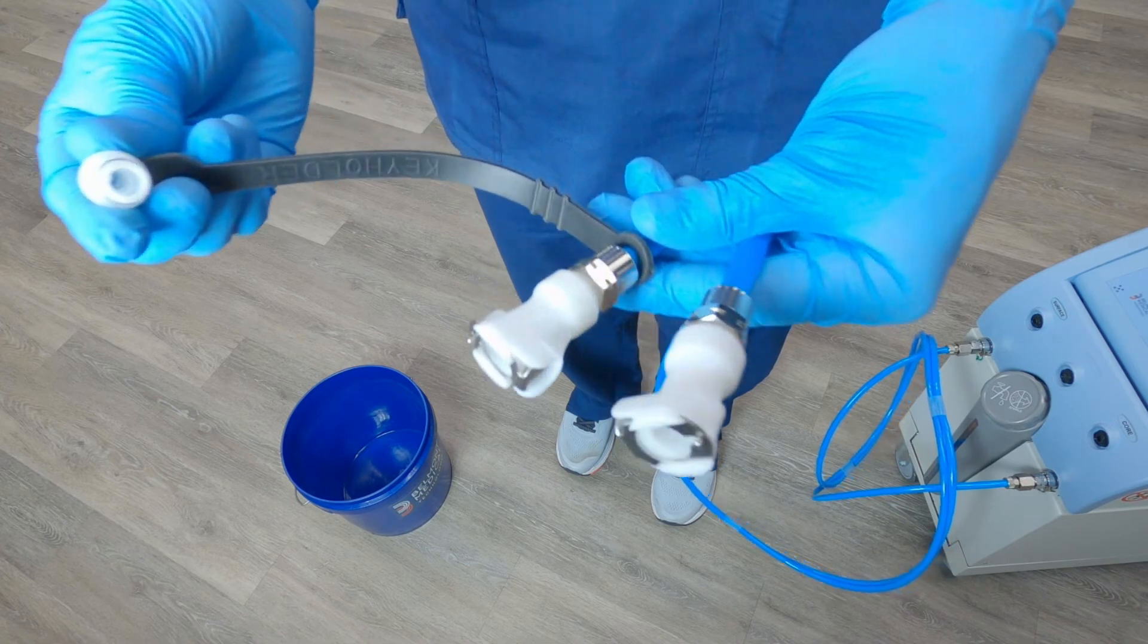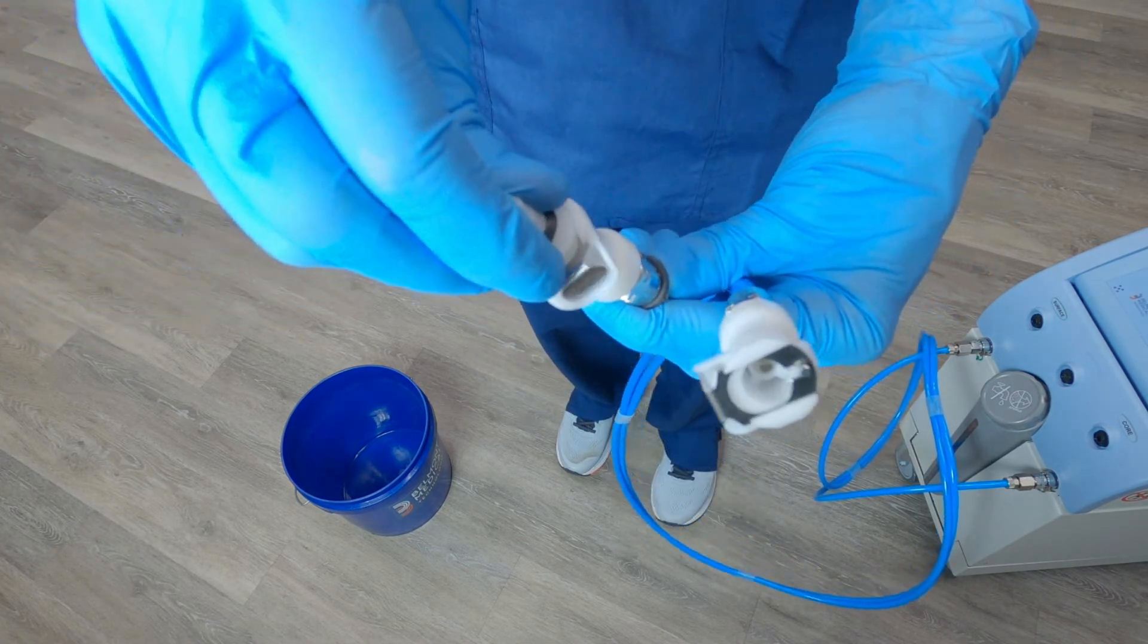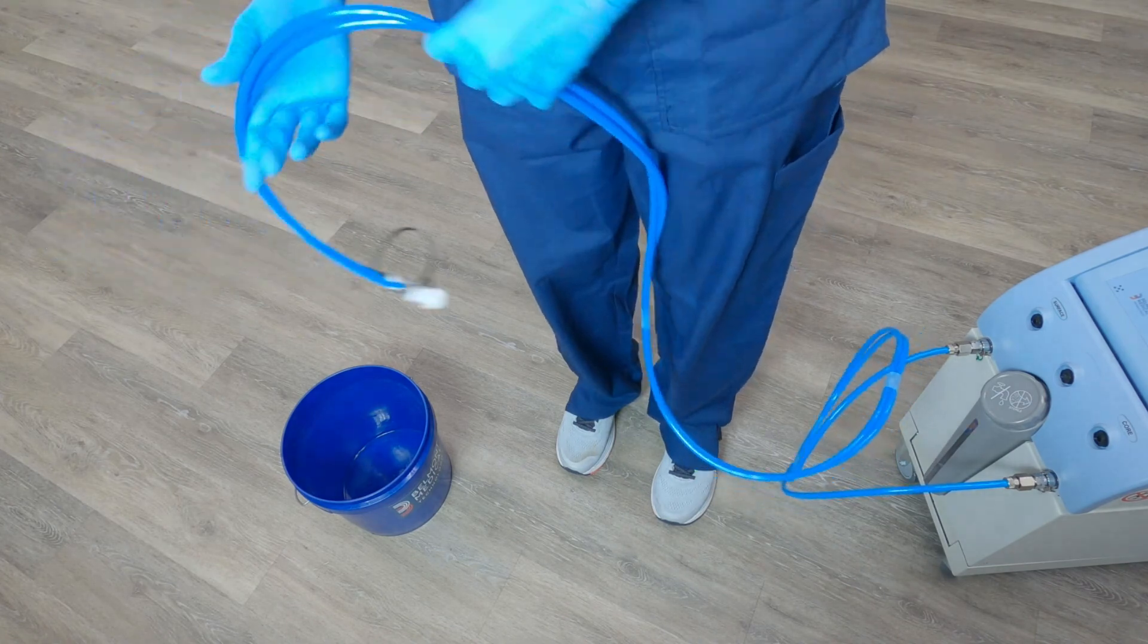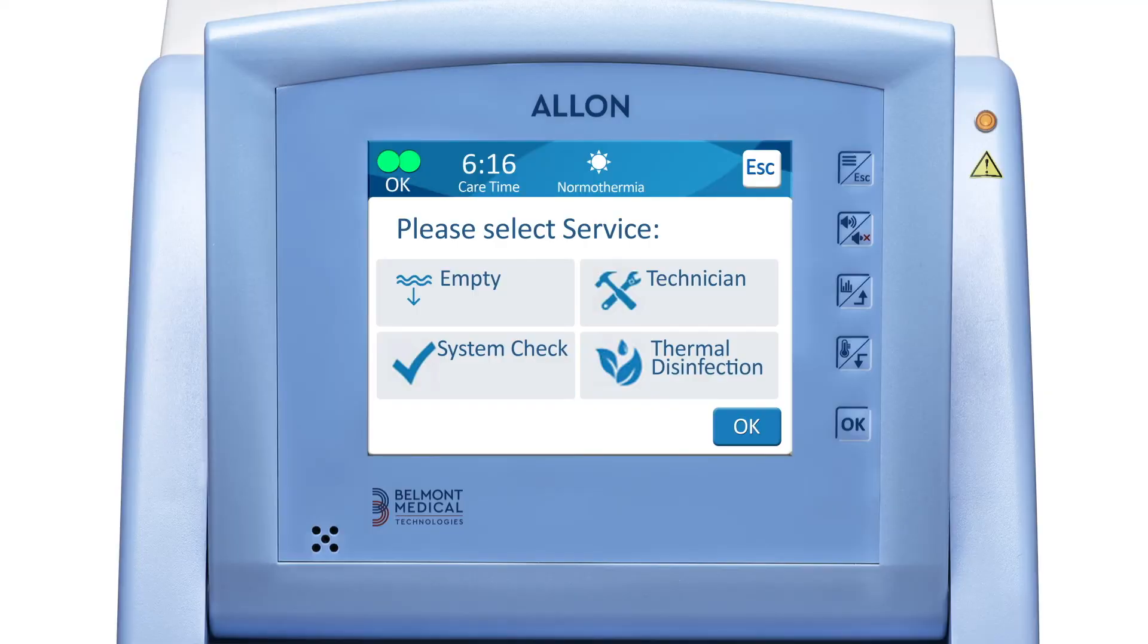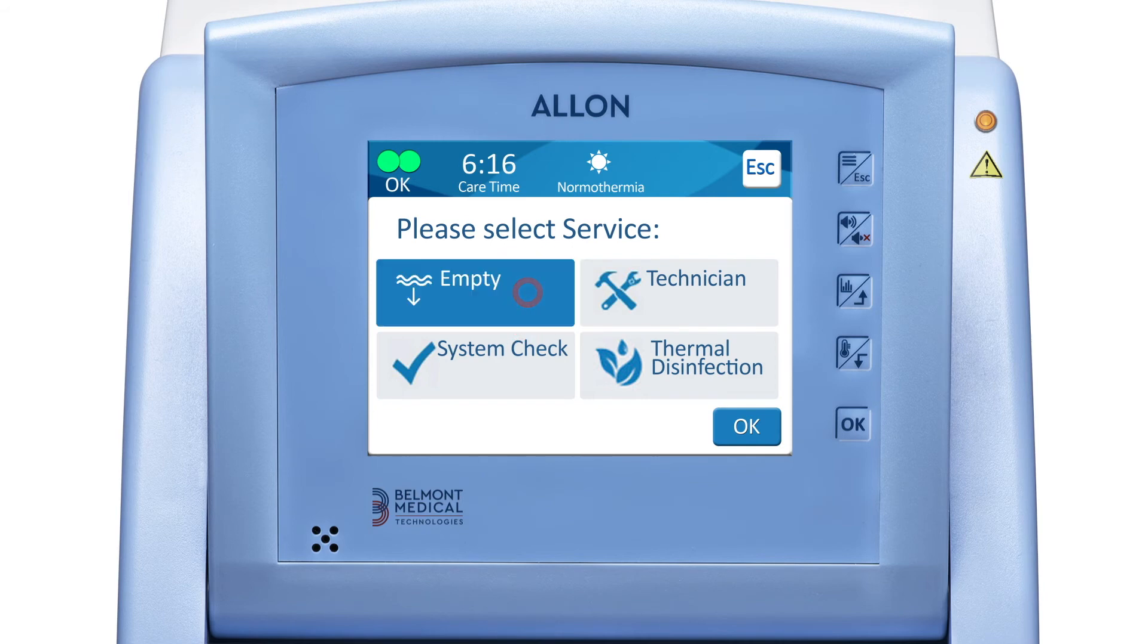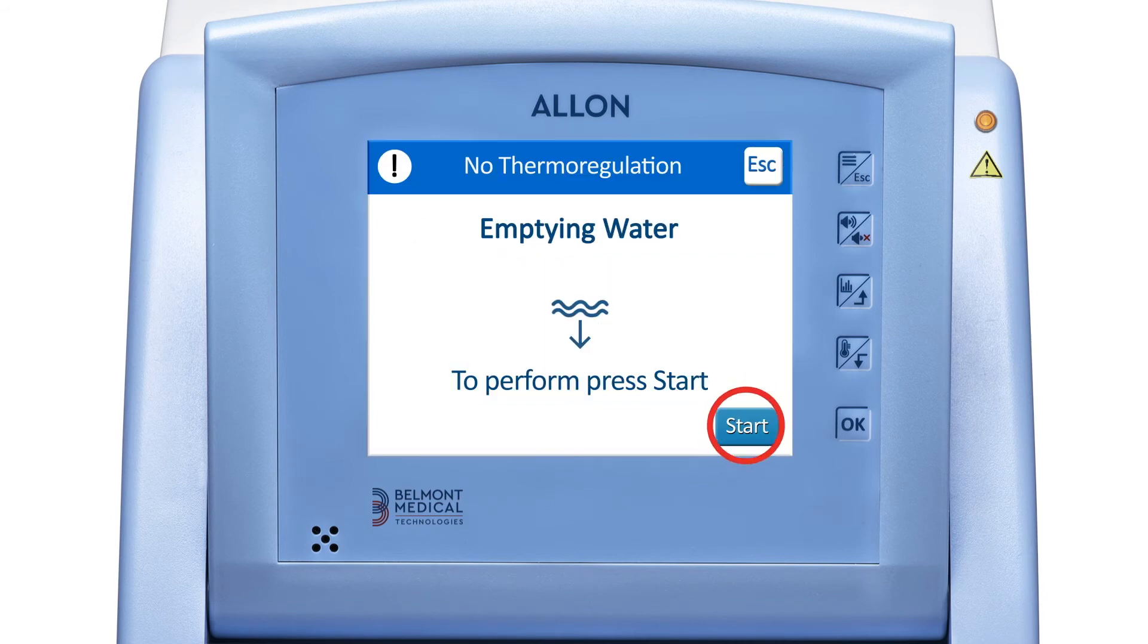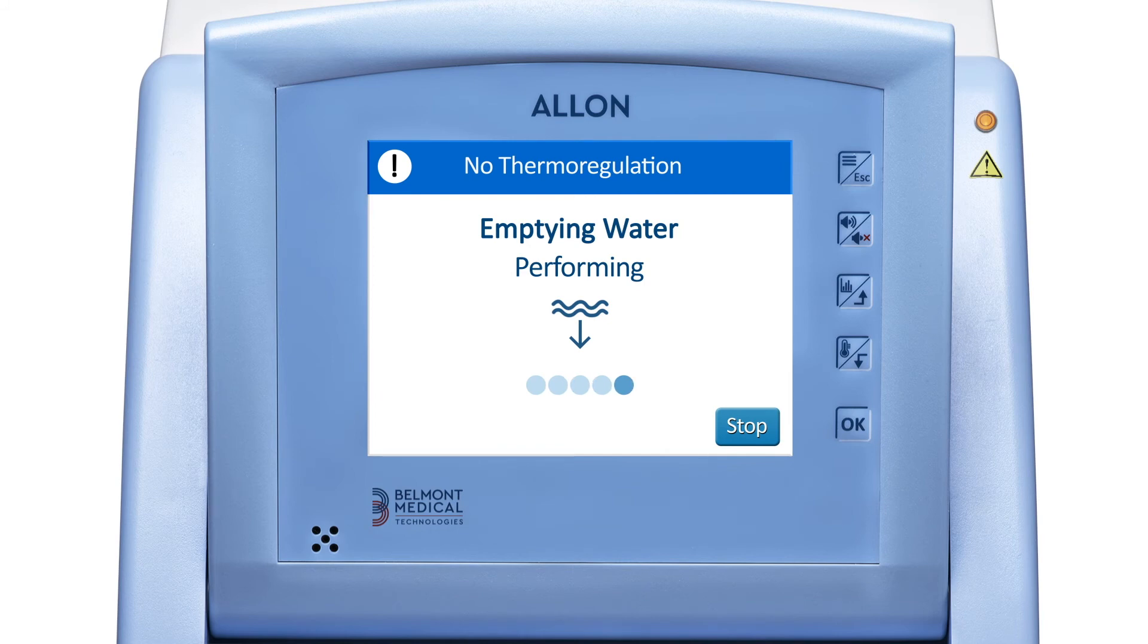To empty Alon, insert the draining connector into the water out on the plastic end of the hoses and aim the draining connector into a sink or bucket. Navigate to the service screen and then press empty. Press start when you're ready to begin. Alon will inform you when it has completed the emptying cycle.